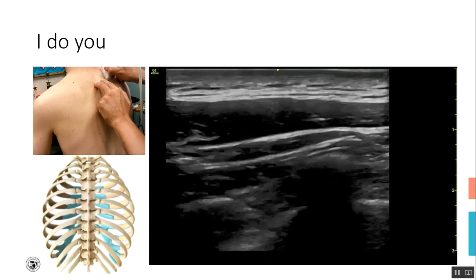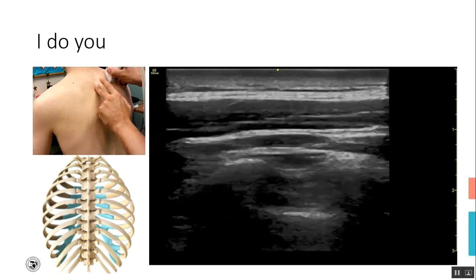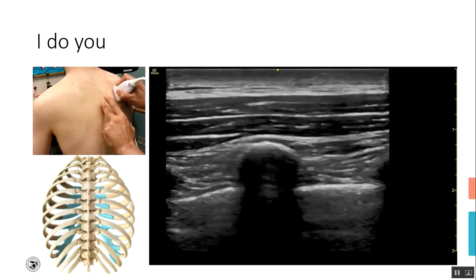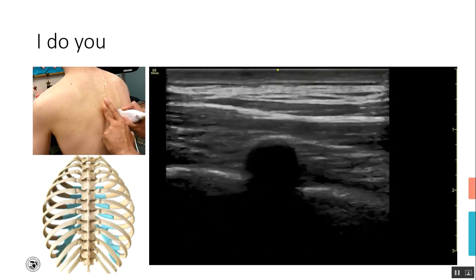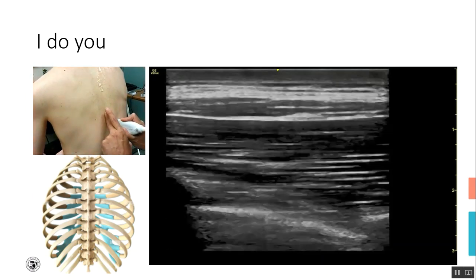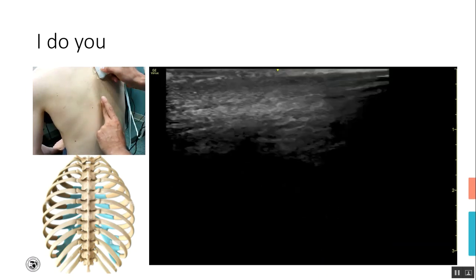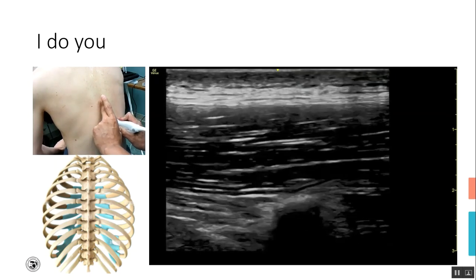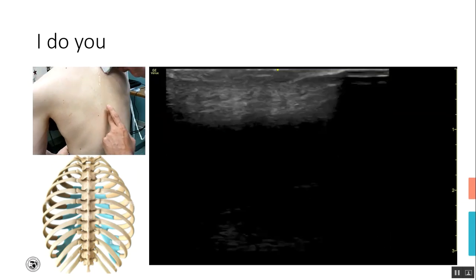We go counting the ribs from top down, when we can see the first rib, then the second, third, fourth, fifth, sixth, seventh, eighth, ninth, 10th, and then the 11th. Then I'm placing my thumb next to that spot and getting more gel so I can find the 12th. Now the 12th has a different structure, it's much more vertical and it will seem slender.